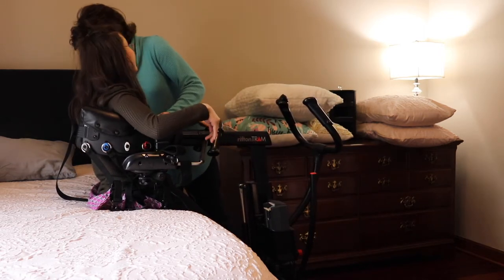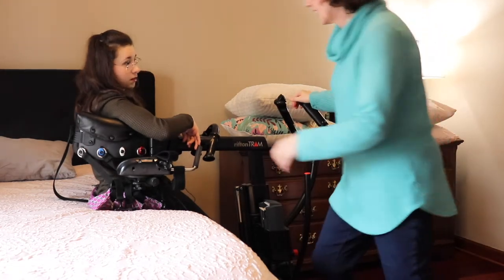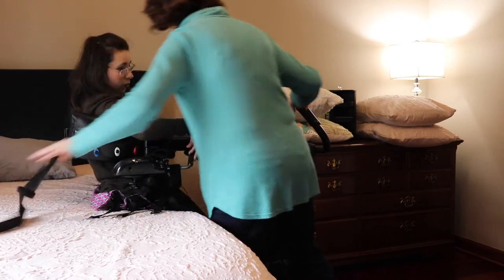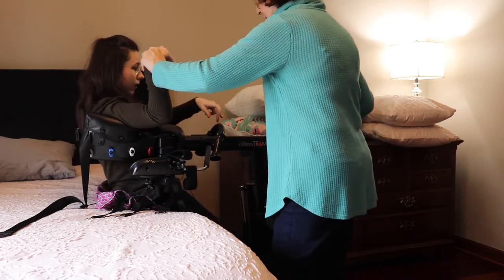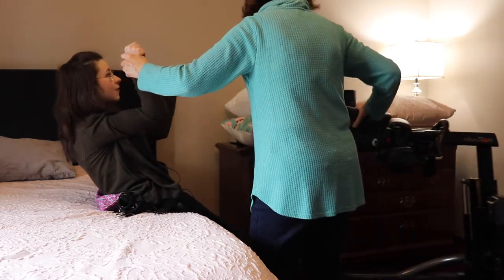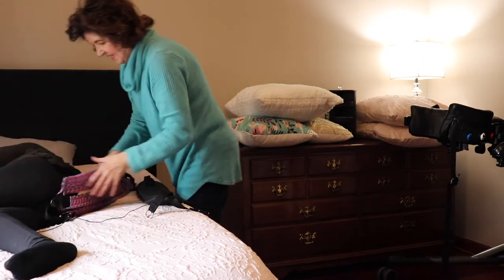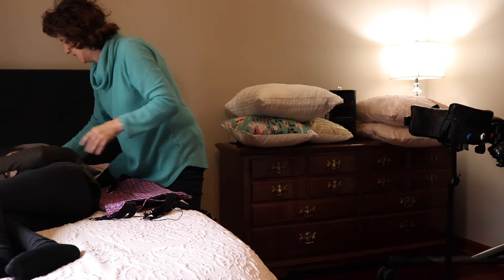Sometimes it gets a little questionable. Undo it down some more — the front one. You got to loosen the slack a little bit for these to work. You guys can see the rings right there. There are also two handles. I could either hold it there with my elbows, like when I walk. When I walk I use this little thingy on the front — I'll show you that close-up. And then I take it out. Then I lean you back, and I turn to my side like I always do, and I lift you up and put you under the pillow. But we're not going to do that for today. So that's how we get into bed.